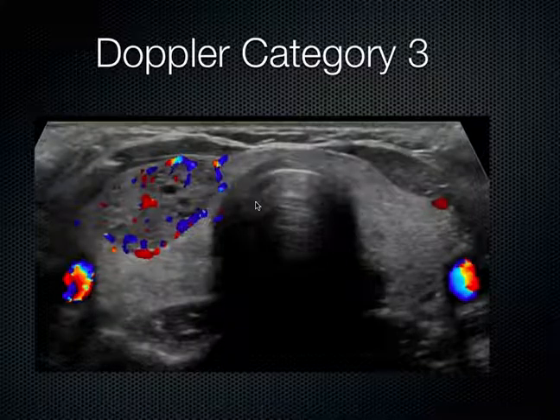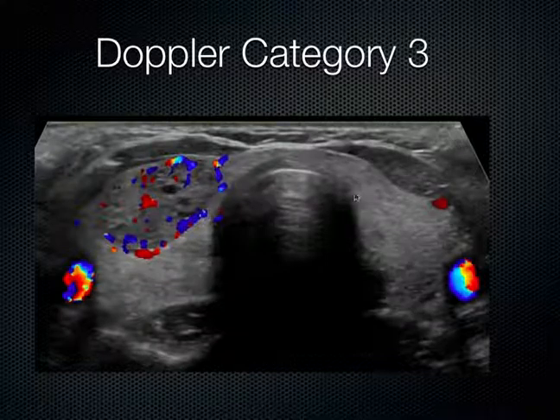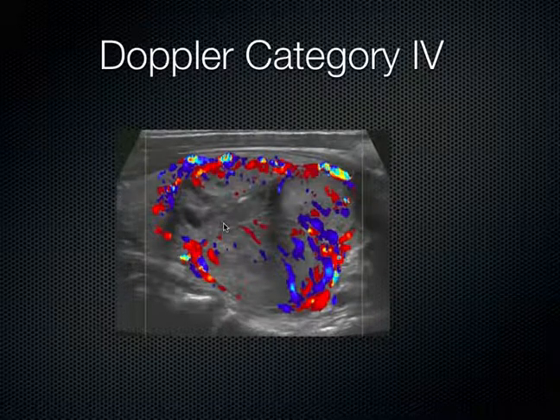This next one is a grade 3 penetrating color flow mapping with a moderately rich vasculature. We can make out the carotid arteries bilaterally. The left thyroid looks pretty normal. Here's the isthmus. We come across the right thyroid and it's got this nodule — this hypoechoic mass anterior to the rest of its thyroid — showing a moderately rich vascular component consistent with a Doppler category 3 type of mapping. And here's a category 4 high-velocity penetrating flow mapping that's very vascularly rich, with a lot of high-velocity penetrating flow seen in this particular nodule.